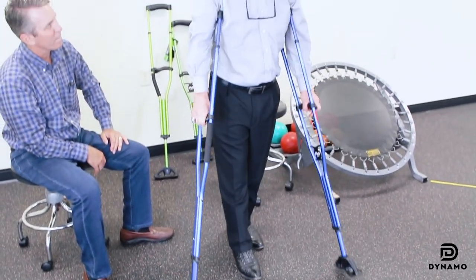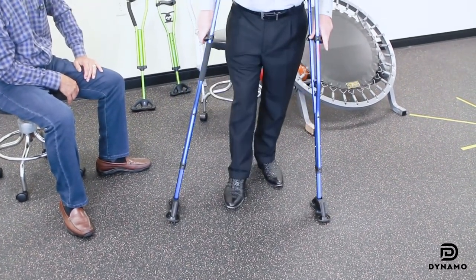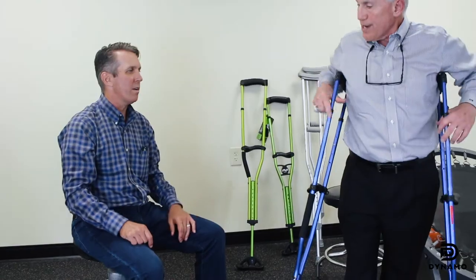Even if I bring both crutches — if I've got a three-point gait pattern — I can bring both crutches and then bring my normal leg with me. I think that the swing link is absolutely a great addition.